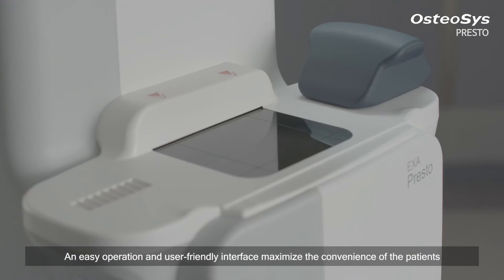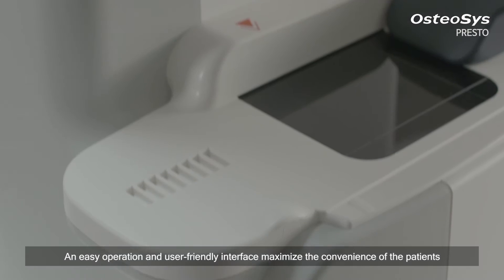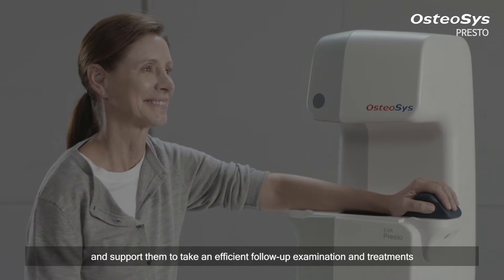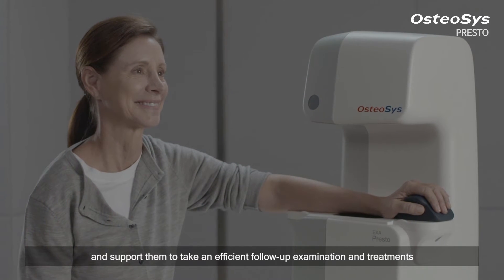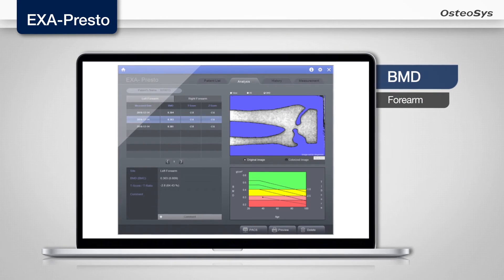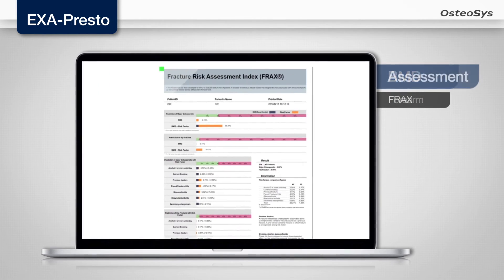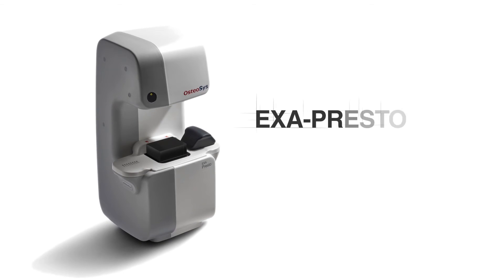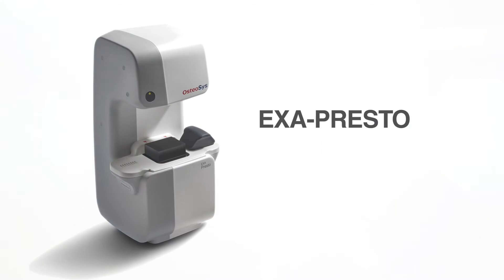An easy operation and user-friendly interface maximize the convenience of the patients and support them to take an efficient follow-up examination and treatments. Better products for better life.